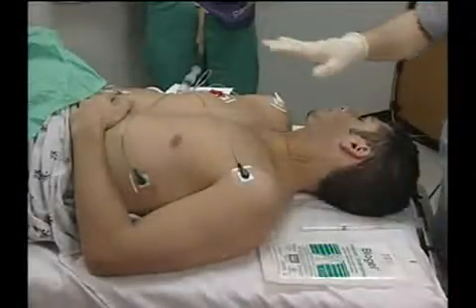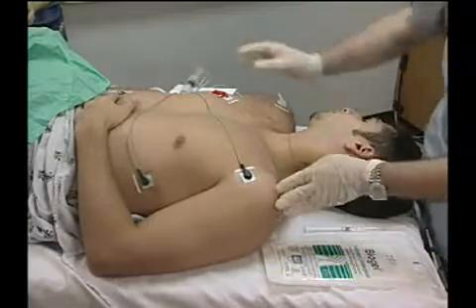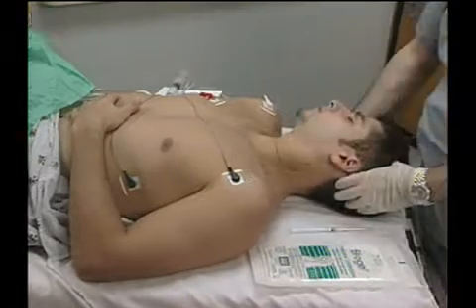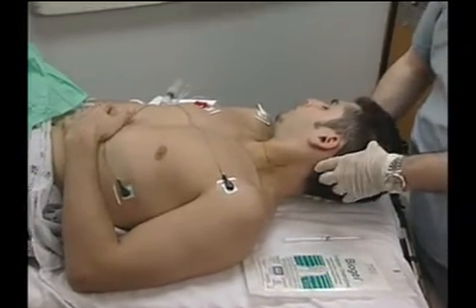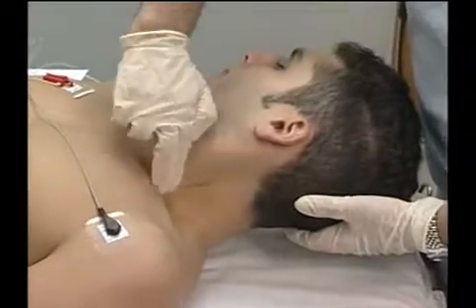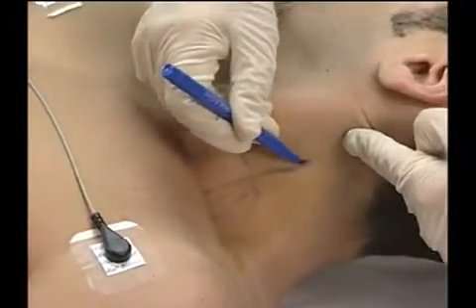The patient is placed in the supine position with the head slightly turned to the opposite side of the block. The shoulder is pushed downward and the elbow at a 90-degree angle with the hand placed on the chest. To better identify the lateral border of the sternocleidomastoid muscle, the patient is asked to raise his head. The interscalene groove between the anterior and middle scalene muscles is identified and marked by rolling the fingers posterior and lateral to the sternocleidomastoid muscle.